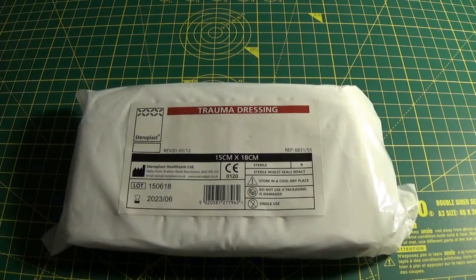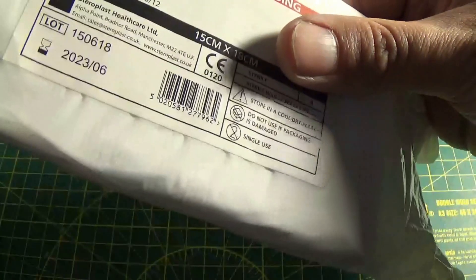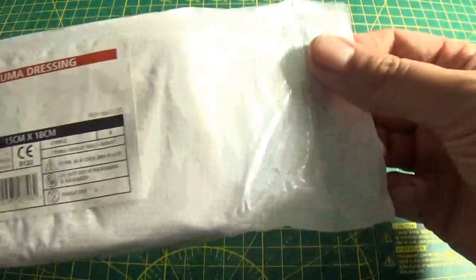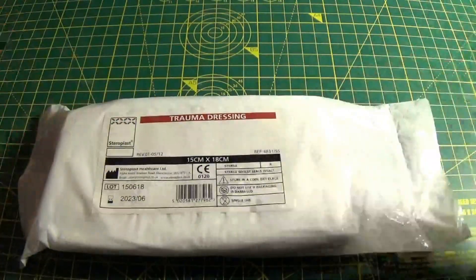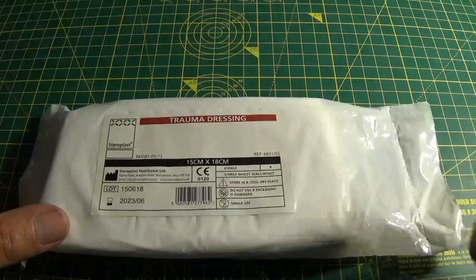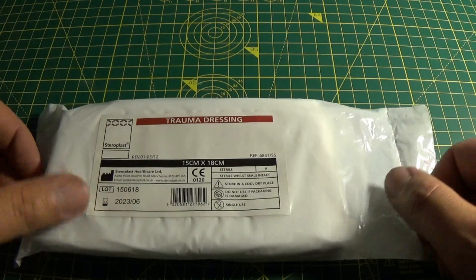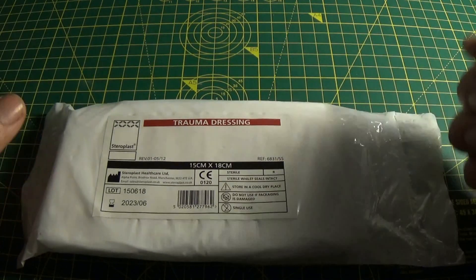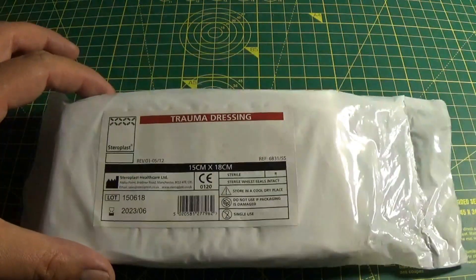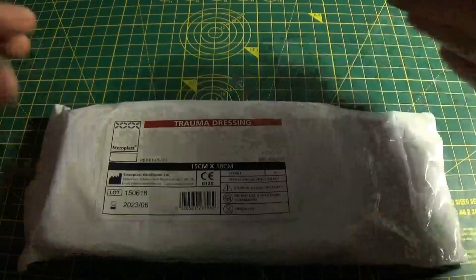So without further ado, let's take a look at what you get. This is your outside packaging. It does have some easy tear in it — there's one there and one here. So it's very easy to get into the outside packaging. On the outside you have all the information, serial numbers, and when it runs out of date. These have a really long shelf life on them so don't need to worry about that. This particular one is a 15cm by 18cm version.